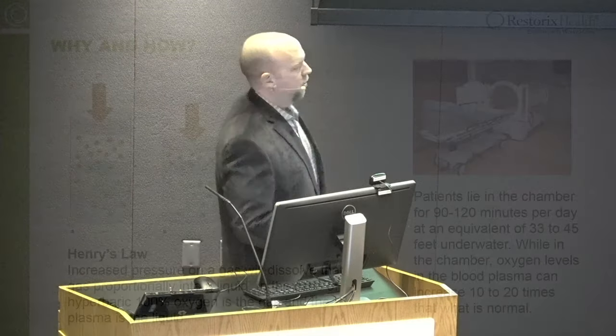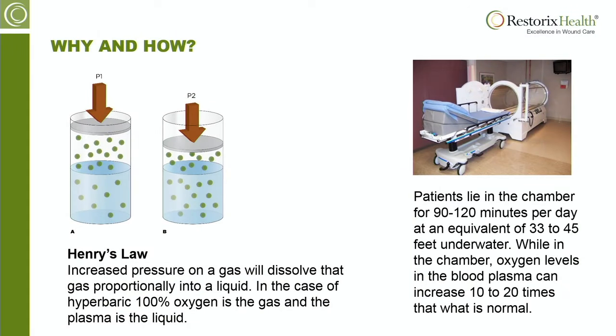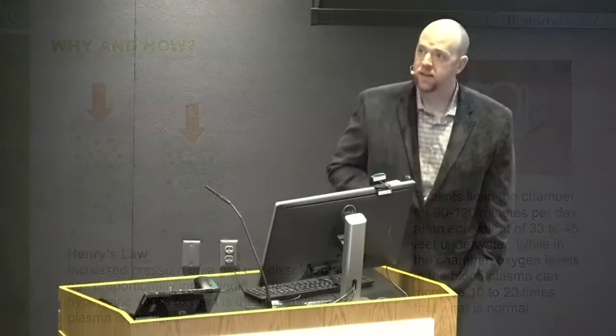So hyperbaric oxygen therapy is a fancy term. Basically, all it means is high pressure oxygen. And as you just learned, your patients are getting a wonderful resource here. They're going to have a new program. Not every patient that walks through the door of your center is going to need hyperbaric oxygen therapy. But as you were learning about the more advanced wound care modalities, the ability to do those advanced modalities for patients that need it, that really sets your program apart. Hyperbarics is another piece of that puzzle.